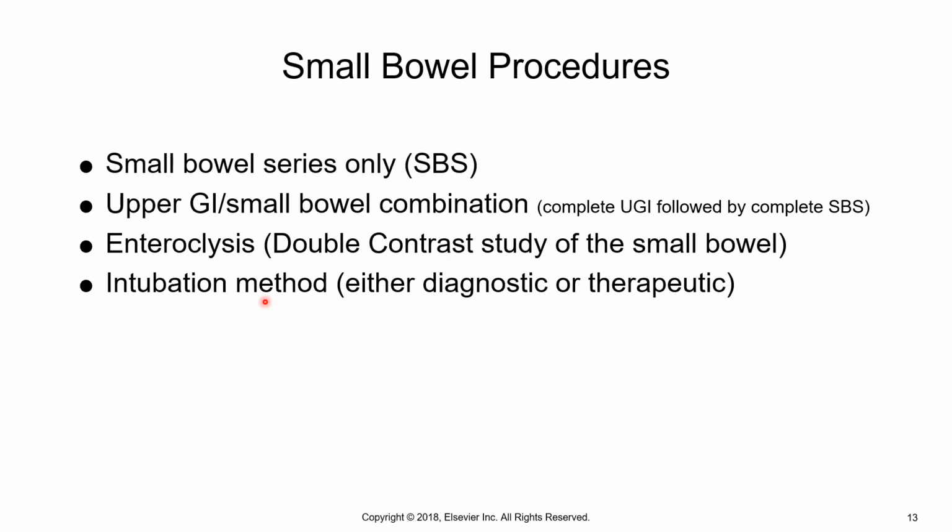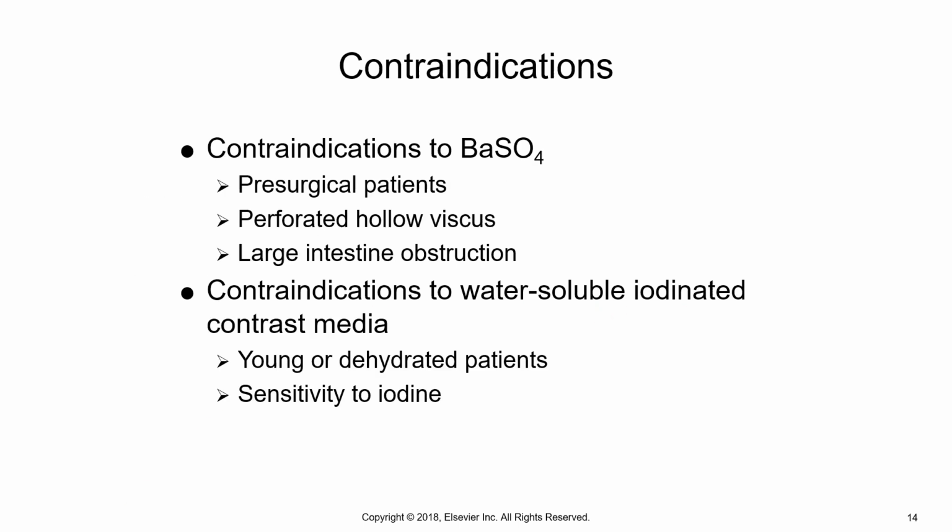And with the intubation method, there are two types. There's either a diagnostic intubation method or a therapeutic intubation method. Okay. On the contraindications, they are the same as any other fluoro study or barium study that we've talked about.